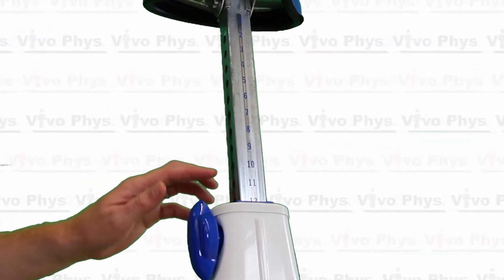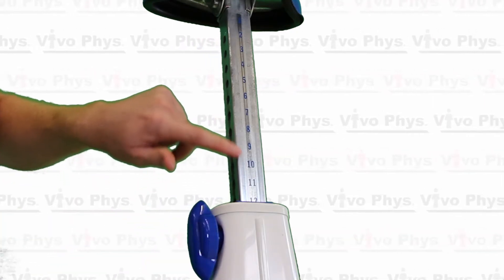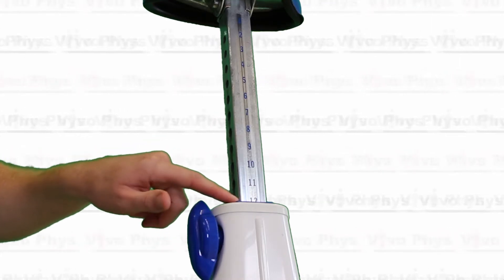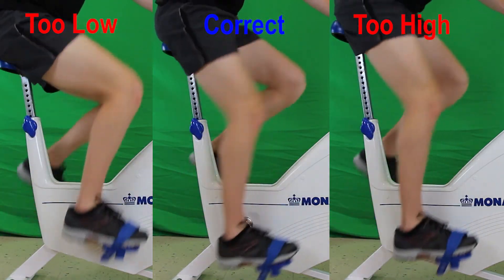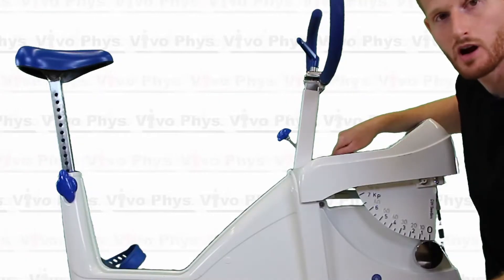When you're adjusting the seat height, if you're going to use this bike more than one time for the same person, you can simply look at the numbers here on the shaft of the bicycle seat and you can replicate the seat height in the future so that you don't have to go through a trial and error process. It's always going to be a trial and error seeing if it's too high or too low.